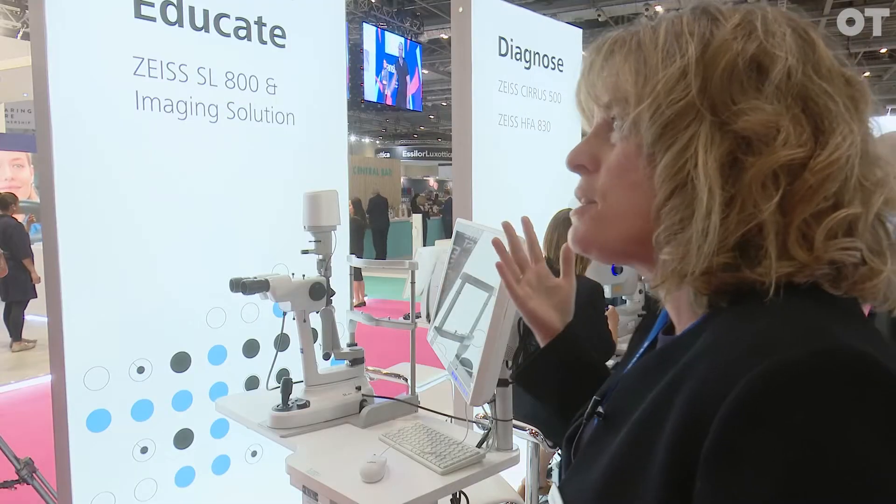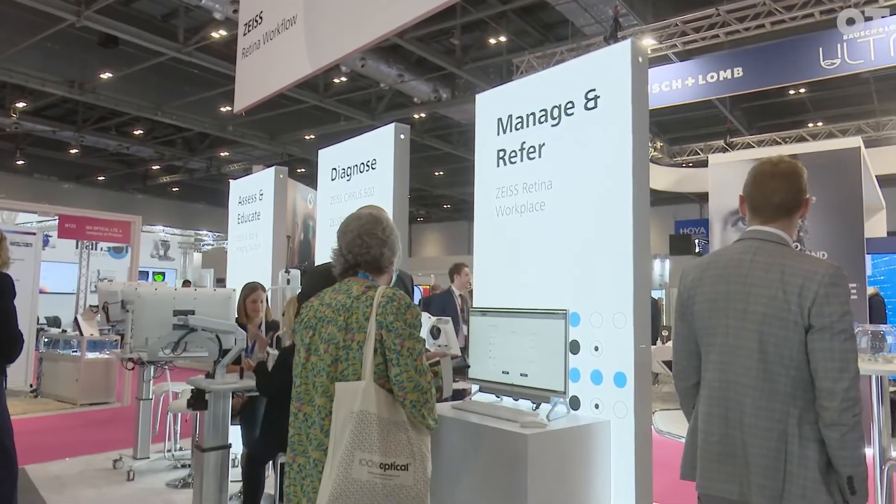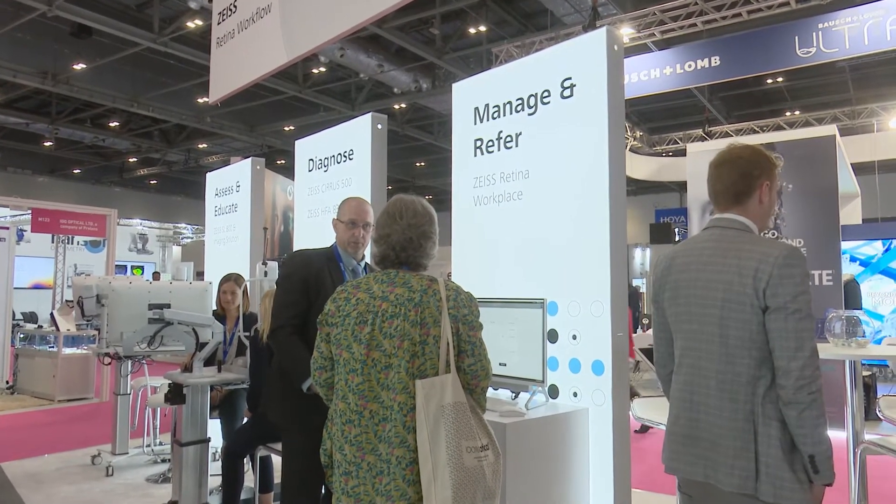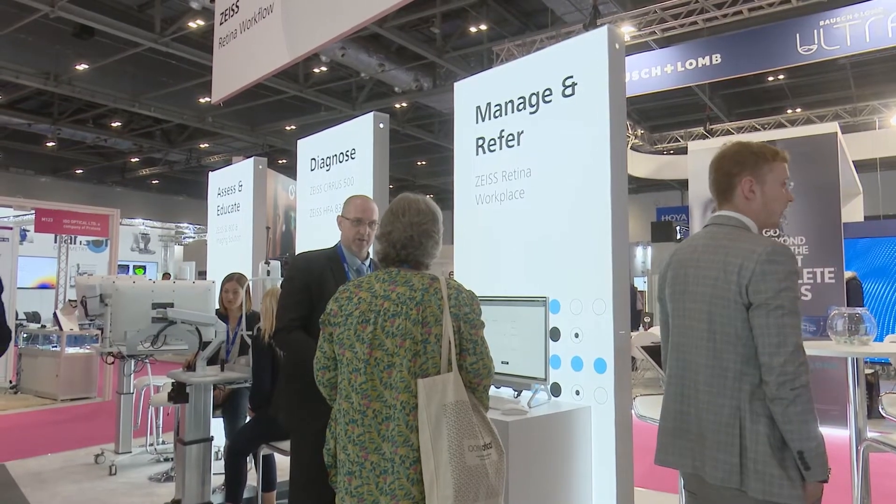When you want to manage or refer disease, you use a data management system such as our Forum, which takes all the information you've collected and lets you really fine-tune what's going on with your patient. It's the patient journey you're looking at — whether it be retina or glaucoma — taking the optometrist from the start point right to the very end point.